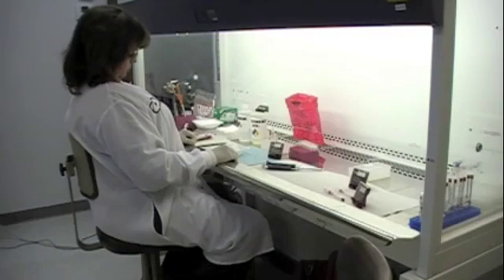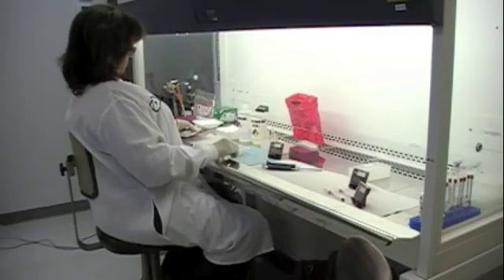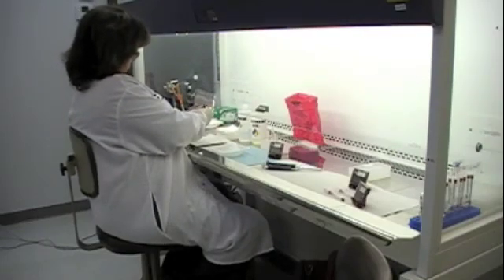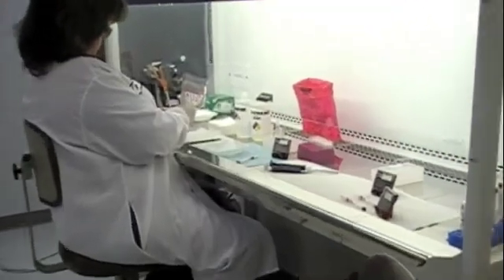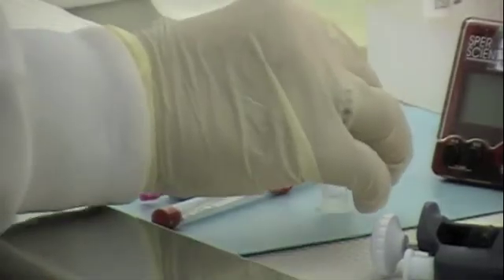First, we take the express HIV test pouch and remove the test components from it. The test components included are the express HIV device, the safety lancet, and the diluent pod.